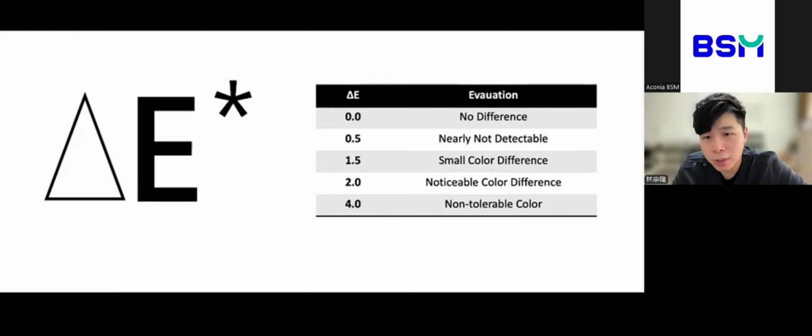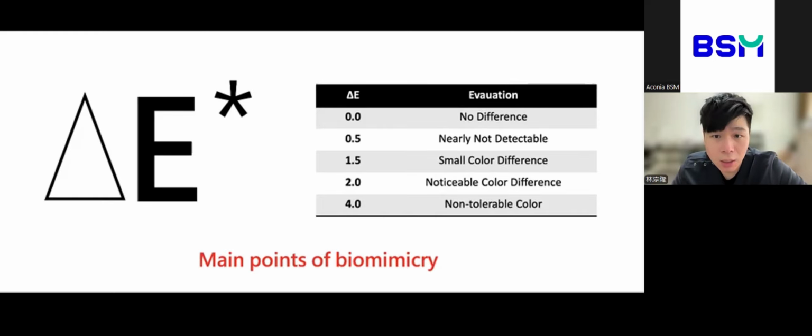And with all these digital shade verification tools available today, matching the value is actually not that difficult anymore. But the real difference between an average technician and a high-level technician is the overall finish and the quality of the details. This is what really makes you competitive in today's environment.